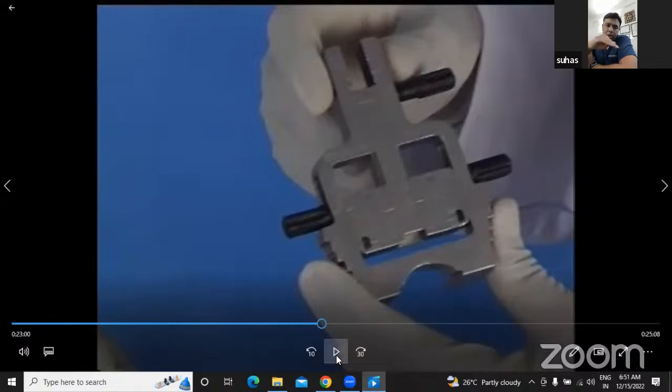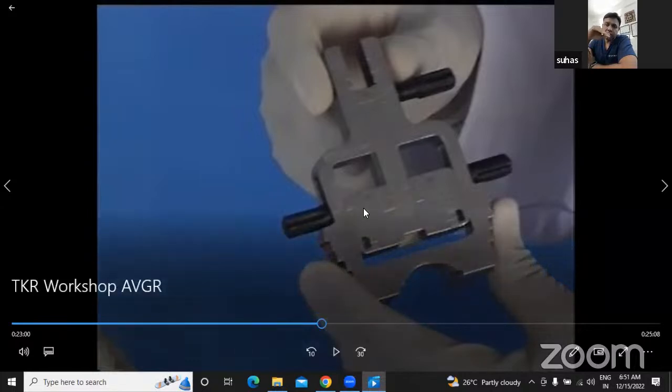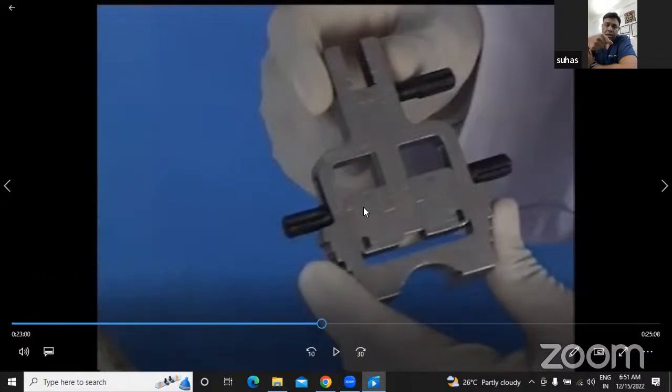So if you hit the bone, it will skive and then start at a different point. So for the saw blade to have very good tension and be stiff, it has to be running before you hit the bone. I always see fellows who first hit the bone and then start the drill. That's when you will skive and have a wrong cut. So it's important to have it already on before you hit the bone.